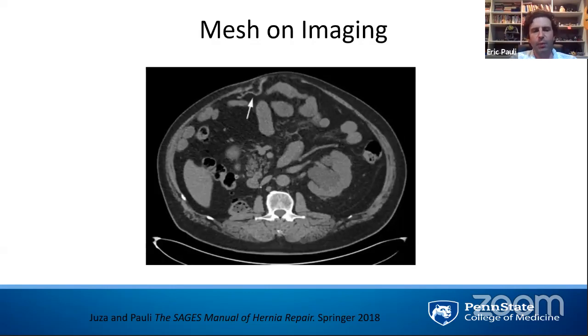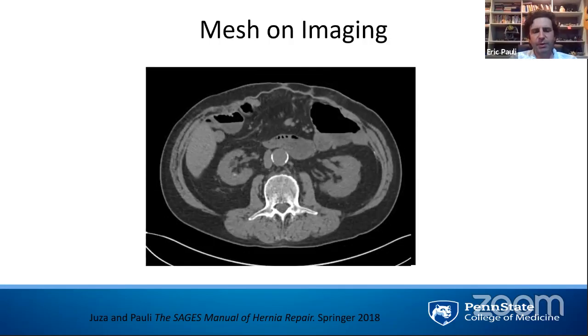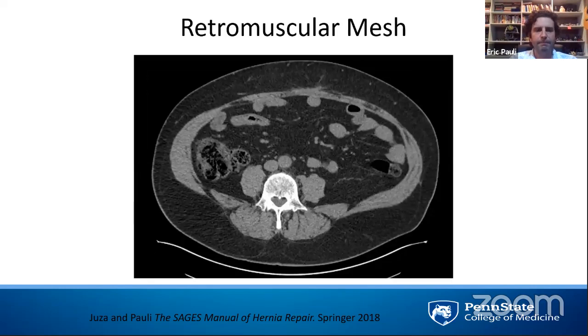Another piece of mesh on the abdominal wall, similar to that first piece that I showed you. Again, this non-anatomic fold and wrinkle that really shouldn't be here. This is a report that was read as a diastasis of the midline. This is a patient of mine who had a bridged repair as a temporizing hernia surgery with a piece of bioabsorbable mesh. And so radiology read this as no hernia, and I looked at it and said, yep, big hernia with a piece of mesh that's eventually going to go away. And so this was our pre-op scan prior to doing this patient's definitive repair.